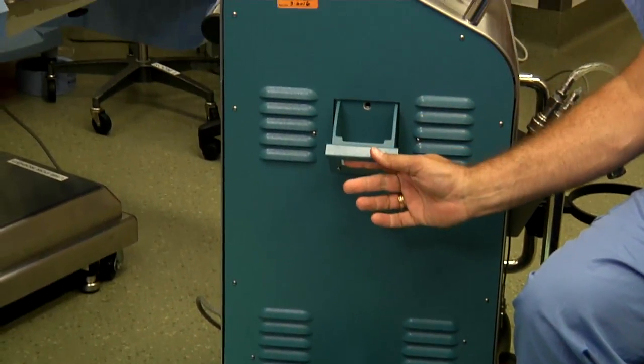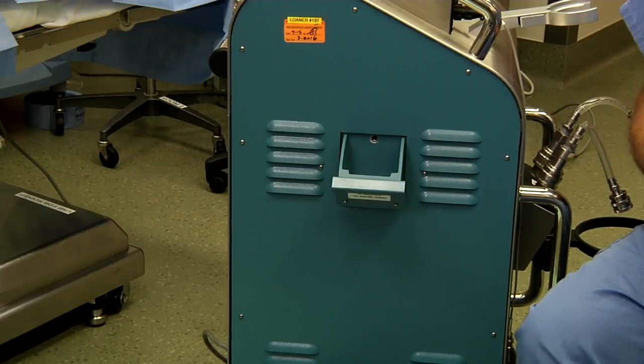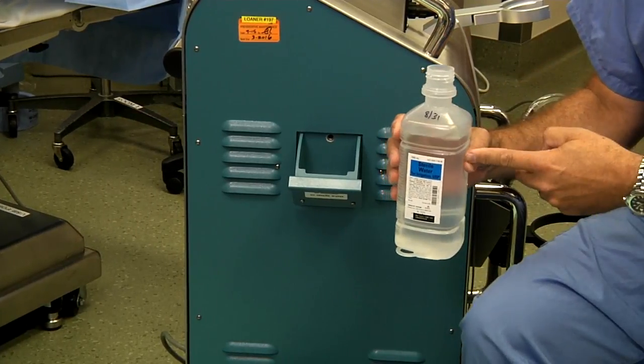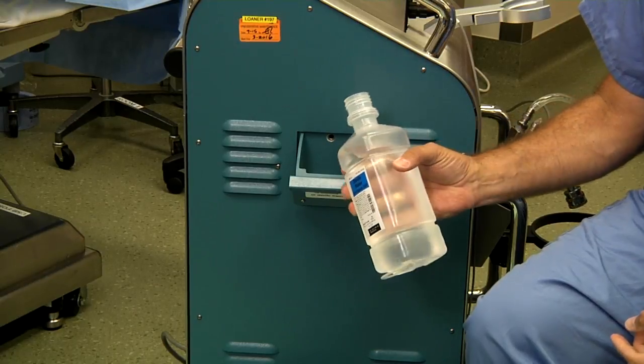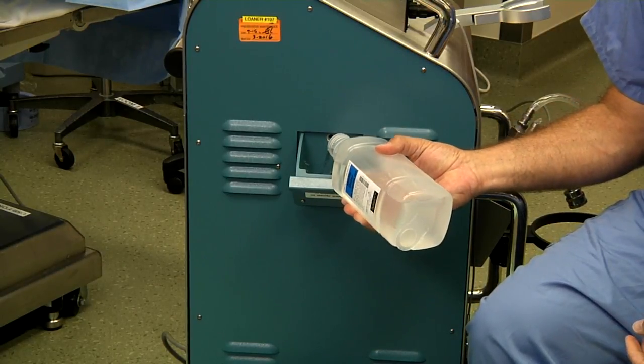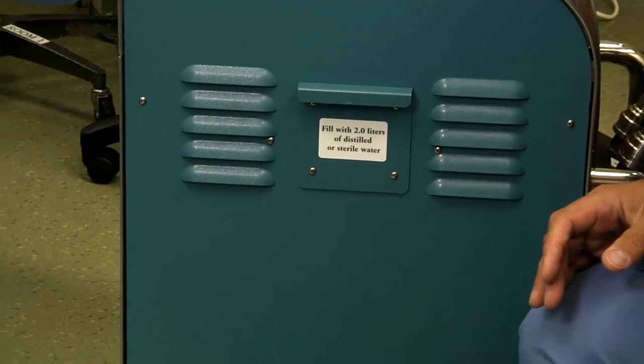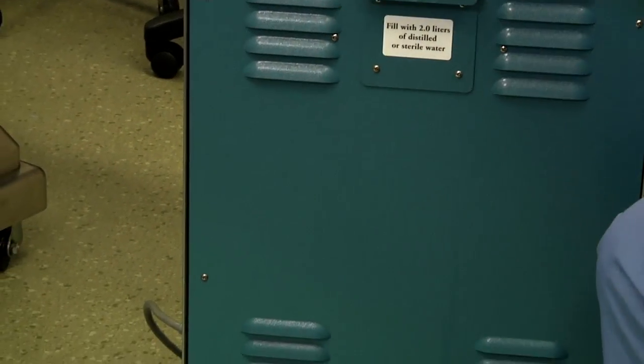Following that, you'll pull open the water fill tray and two liters of sterile or distilled water will be added to the fill tray. The tray is then closed and the device can be powered on.